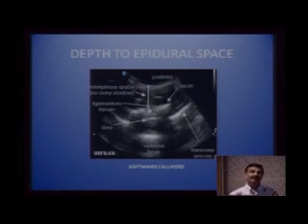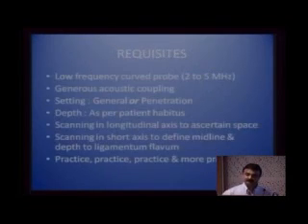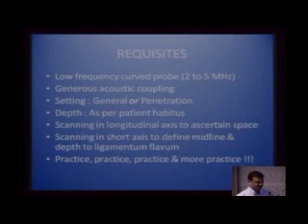And it is at that distance you would expect your needle to actually puncture the ligamentum flavum and enter the epidural space. So that is how you can calculate depth to the epidural space. And you can also identify at what angle your needle needs to go in order to reach this particular epidural space.